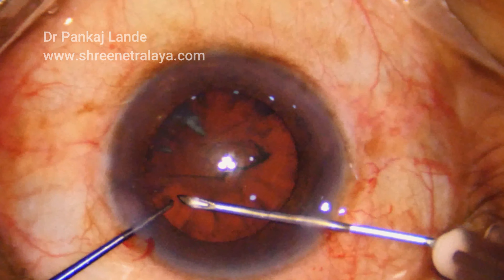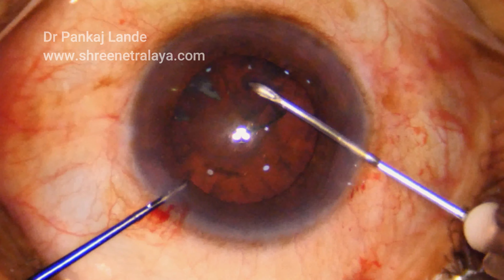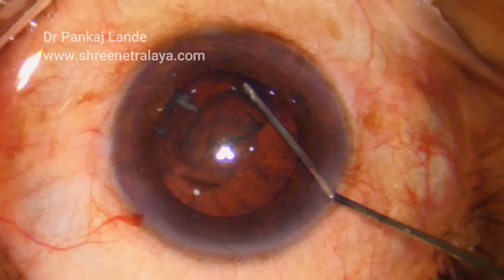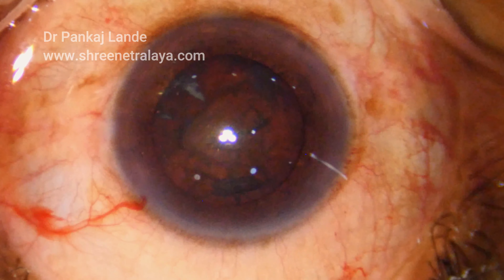This technique is one of the best to manage very hard nuclei, and as compared to mechanical pre-chop, the control of instrumentation is much better and safer in any experienced hand.